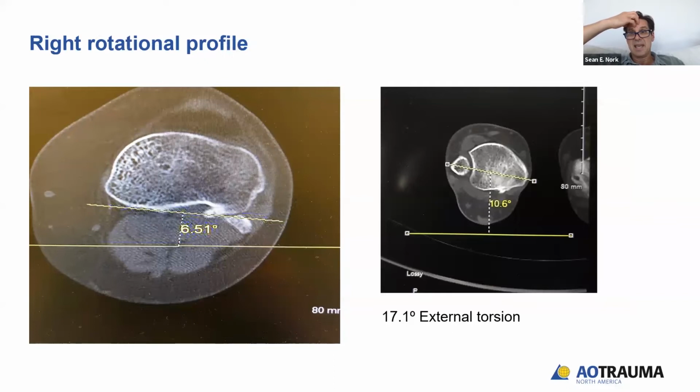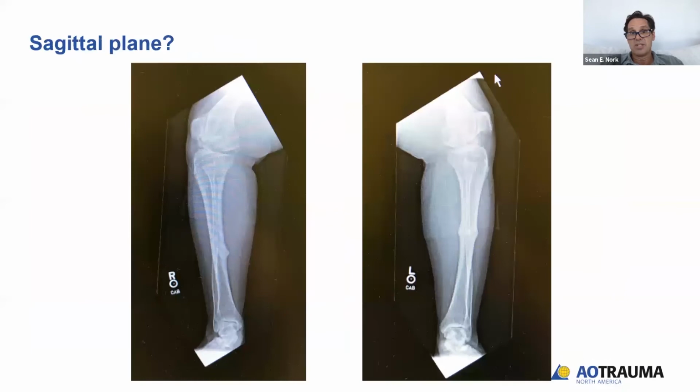But based upon the CT scan, to me, she becomes, with regards to her tibia, a relatively pure coronal plane deformity. Those rotational profiles look reasonable to me at the tibia. So I'd be looking at this as a pure correction of a proximal tibial varus deformity. Okay. And so my vote, everyone else can chime in, but I would probably vote for a biplanar medial proximal tibial opening wedge osteotomy, since she's not tall.